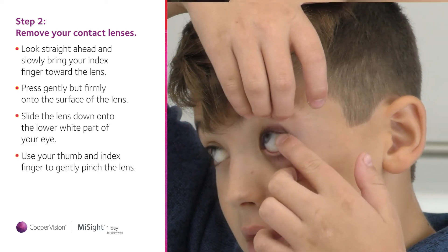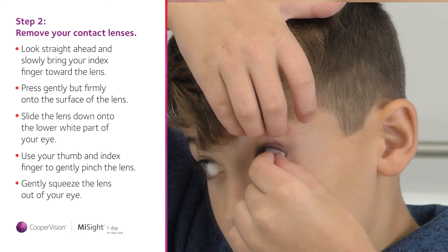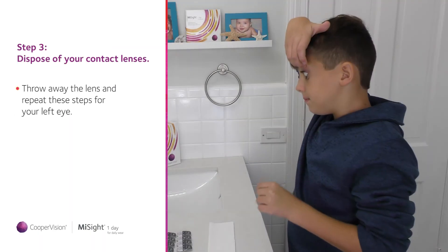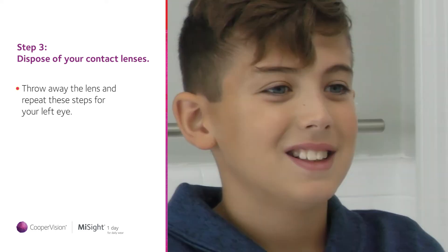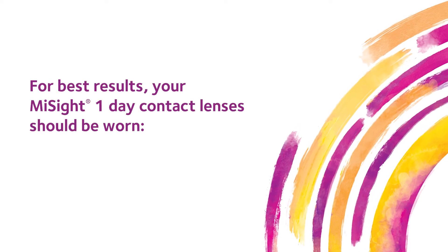Using your thumb and index finger, bring the edges of the lens together in a gentle but firm pinching movement. Once you've removed the lens, all you need to do is throw it away and repeat these steps for your left eye. Then you're all done!